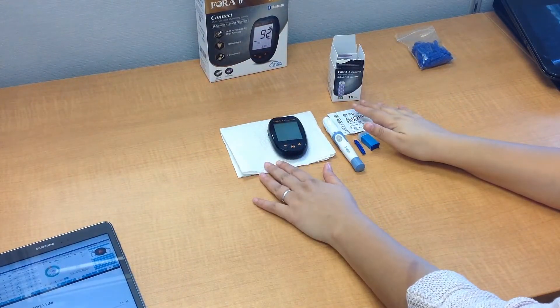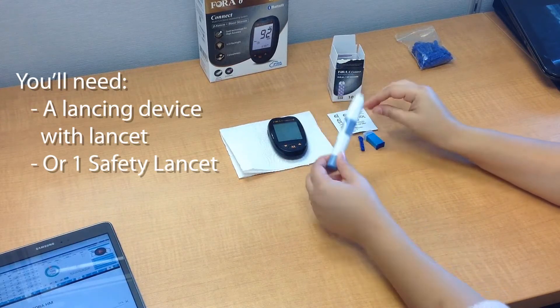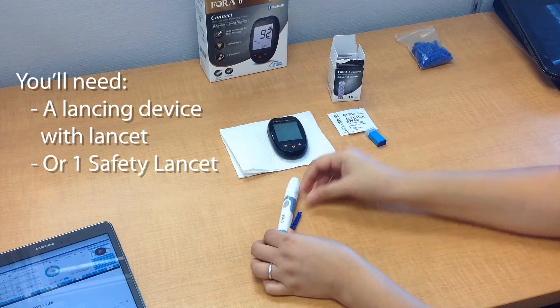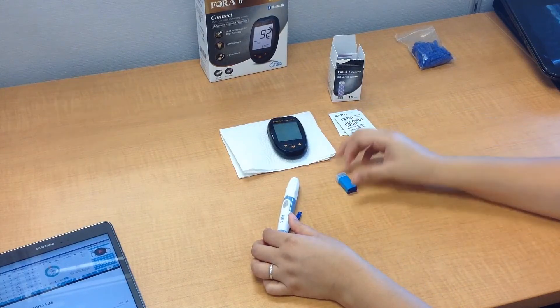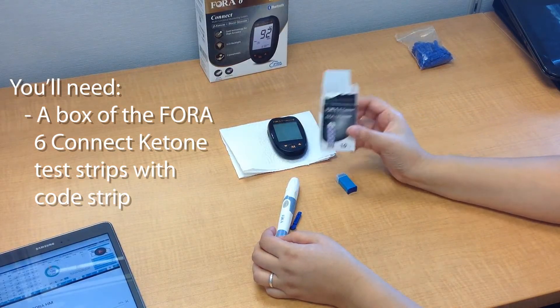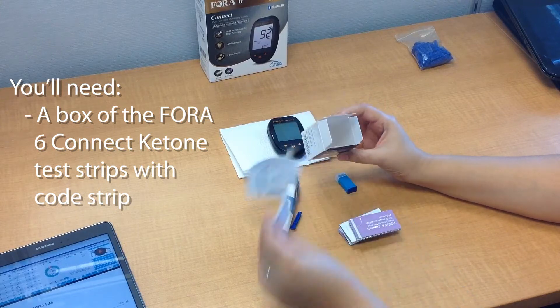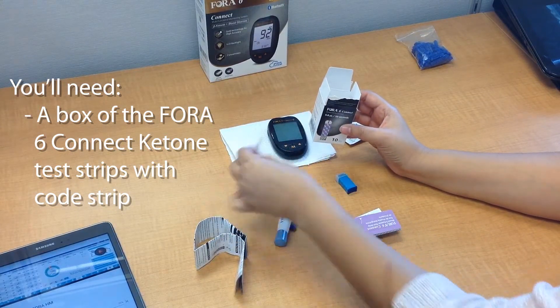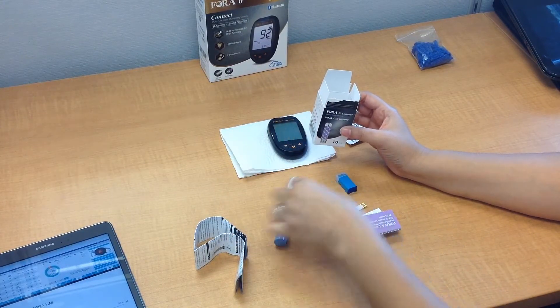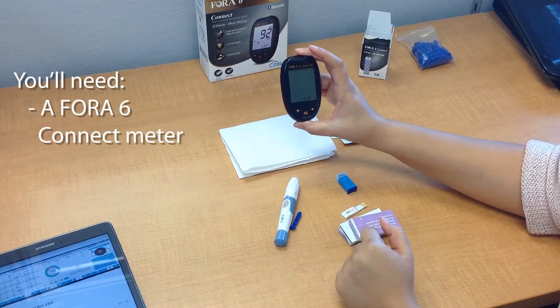Next we're going to make sure that we have all of the required components for this test. You're going to need a lancing device with a lancet or one safety lancet, alcohol swabs, a box of the Fora 6 Connect blood ketone test strips with the included code strip, and your Fora 6 Connect blood ketone meter.